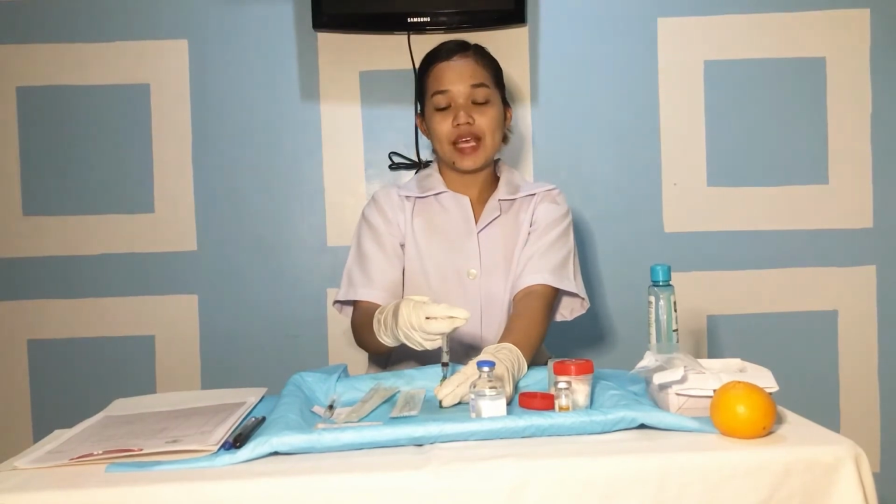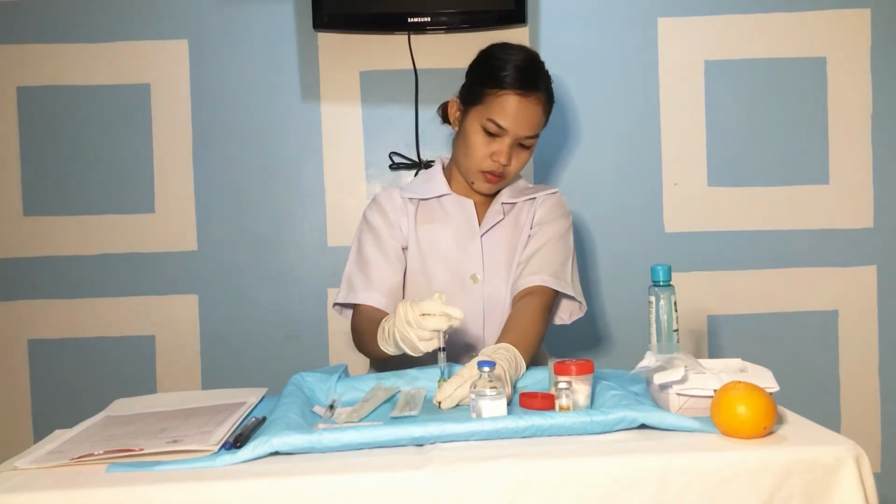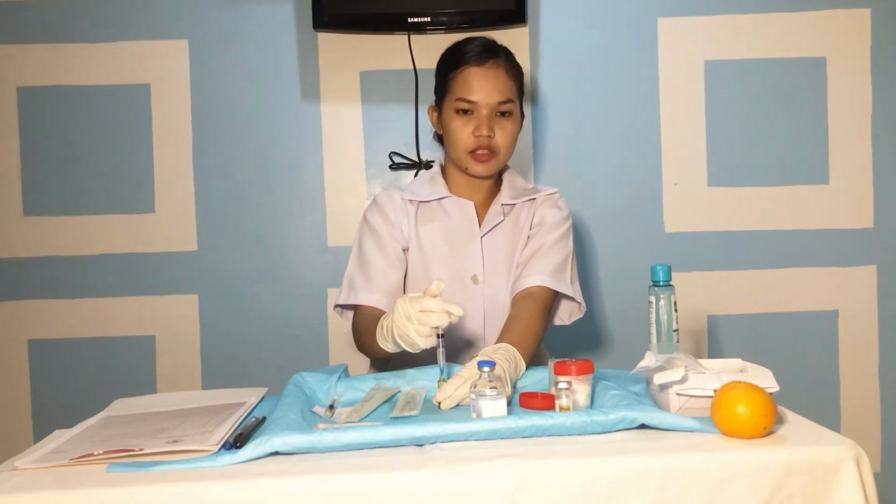Now we aspirate the medication into the syringe by gently pulling back on the plunger. Withdrawal of the plunger creates negative pressure within the syringe barrel, which pulls fluid into the syringe.